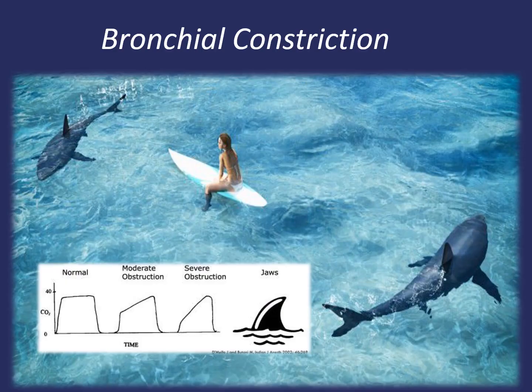Bronchial constriction. So we've all heard reference to the shark fin, and the shark fin waveform is a diagnostic indicator to bronchial constriction as, say, ST elevation would be to an MI patient. Along with presentation of shortness of breath, possible audible wheezing, and/or accessory muscle use, we now have waveform capnography to assess the severity of bronchospasm and how well our patient is responding to treatments.